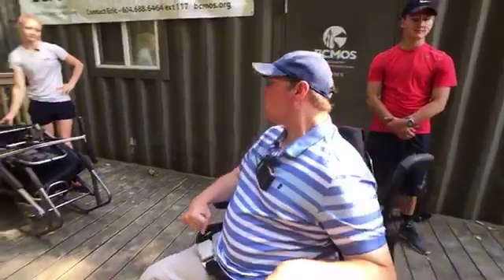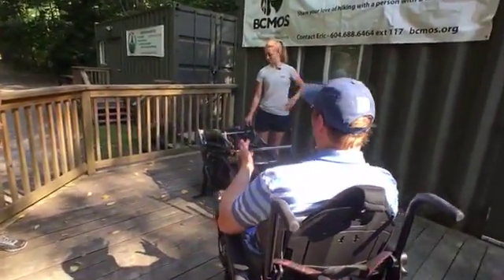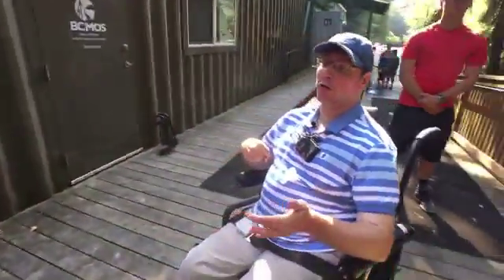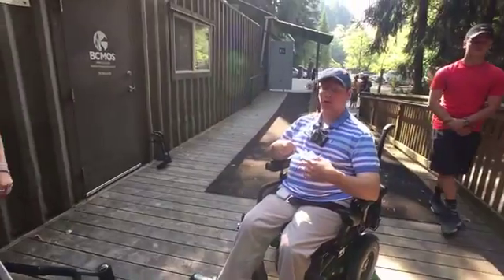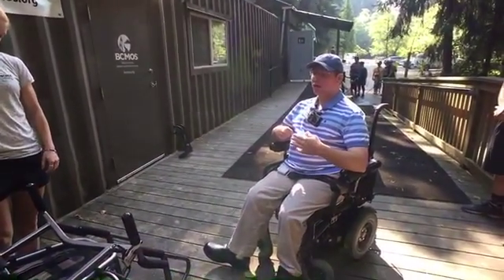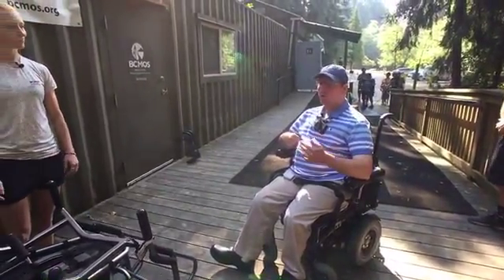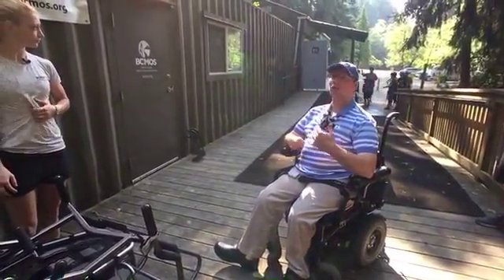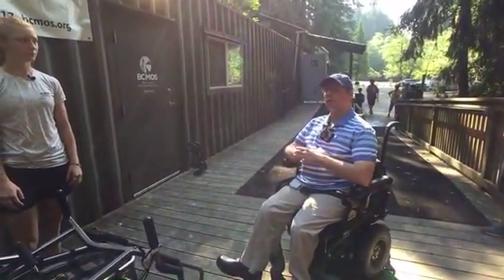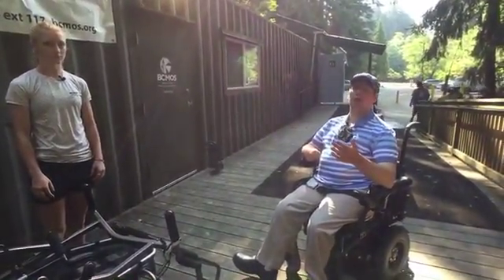Okay. So I'll just move a little closer to it. I guess why we're doing this is, and we're going to showcase this. This is what it looks like folded up. So the full name of it is the Trailrider, and the whole focus is that you're not intimidated. Sometimes people aren't sure what to give a try because you want to know more about it. So the whole goal of our program is to showcase that you can get out there in places that you otherwise may not be able to in a wheelchair. And I've really had some awesome experiences, and hopefully we can showcase that today.